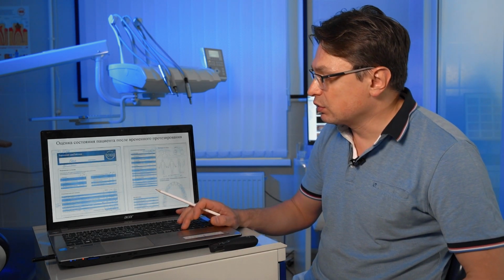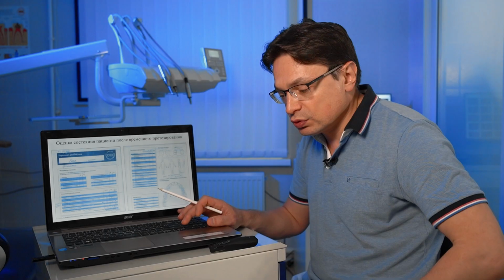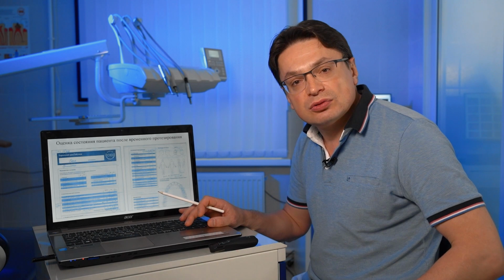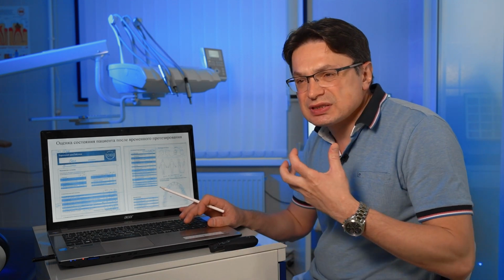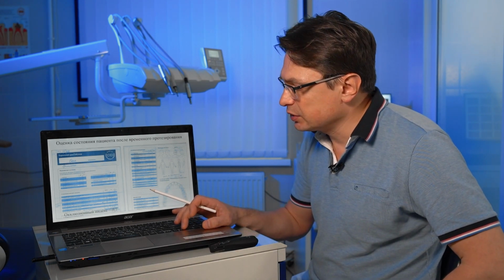So, after providing the correction, we invite the patient again after some time. If something is needed, we correct it again. Once again, patients with temporomandibular joint dysfunction, especially if there is a degenerative dystrophic process in the joint, have unstable occlusion. It's really unstable. It can change. The patient has certain unpleasant sensations, and you have to correct it periodically.